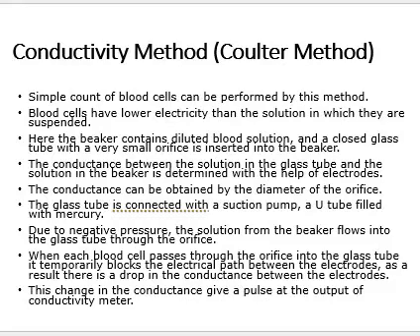Very important point. Whatever I said is related to this, but this is the actual point. There will be a very small hole. When the object, that is, a blood cell, passes through the hole, the conduction stops. When the object has passed the hole, the conduction starts. And again, when any object crosses the hole, conduction stops, and when it has crossed, the conduction is on. So this is the method.